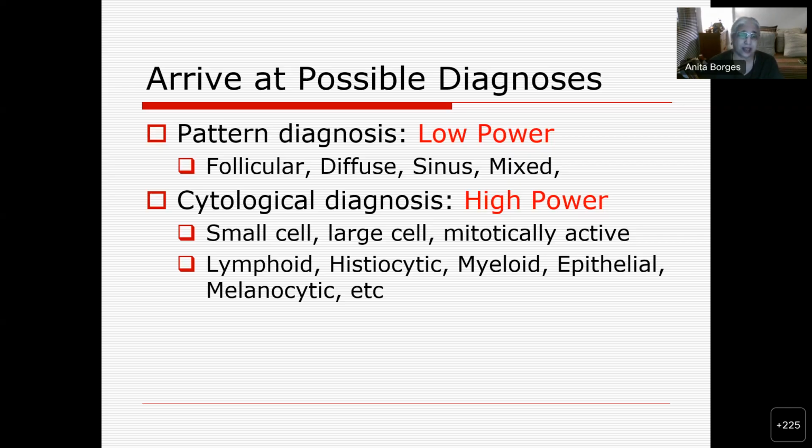So if something is the size of a small lymphocyte, or maybe twice or three times the size of a small lymphocyte, sometimes maybe 5 times the size of a small lymphocyte, you'd probably call it small. Large cells are 10, 12, maybe even 20 times the size of a small lymphocyte. And the next time you see a Reed-Sternberg cell in a nicely prepared preparation, go and compare it to what the small lymphocytes around them are.